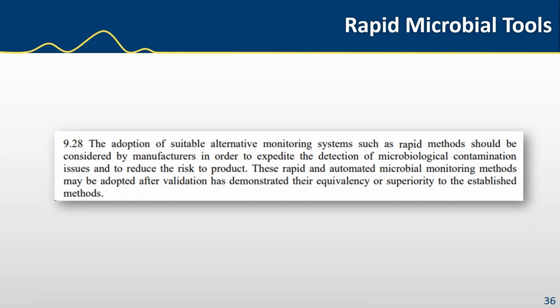And there's also the rapid sampling. So once you've taken your sample with your active air sampler, you can have that incubated by a rapid sampling system that also uses biofluorescence, but it's also using magnification and digital cameras and is able to detect CFUs forming that are not visible to the naked eye. So they reduce the actual incubation periods and the times to identify CFUs down from 72 hours, sometimes down to 4 hours, depending on what you're looking for.